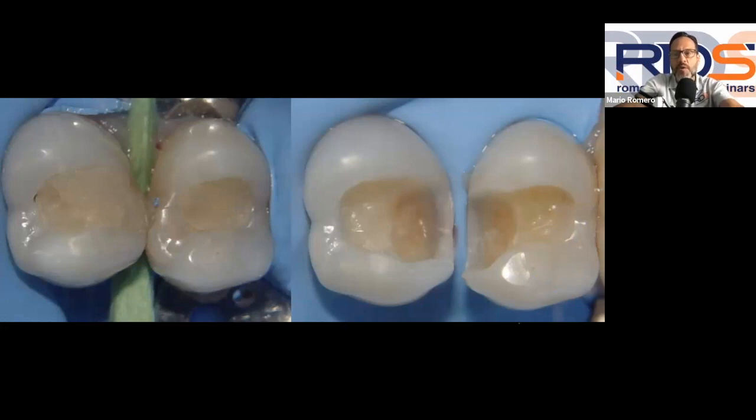As you can see in the photo on the left-hand side, I had one DO and one occlusal composite where, for some reason, they had kept the marginal ridge. But on that interproximal area, there was a small cavitation underneath that marginal ridge that they decided not to remove. When they restored these teeth, both were almost attached together. This patient cannot get floss between these two restorations because they were literally bonded together.